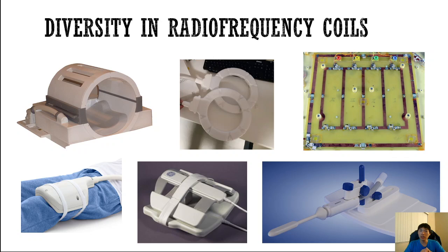These are very general use coils. They're not as homogeneous as, for example, the head coil, but they are a bit more flexible and a bit more portable, so you can put them in different parts of the body. On the top right is a board-shaped coil. This is a compromise for the abdomen for a nice homogeneous, uniform radio frequency excitation, where if you have one element at the top and one element at the bottom, then it's almost like all-the-way-around coverage of the body. So these are used for abdominal imaging.